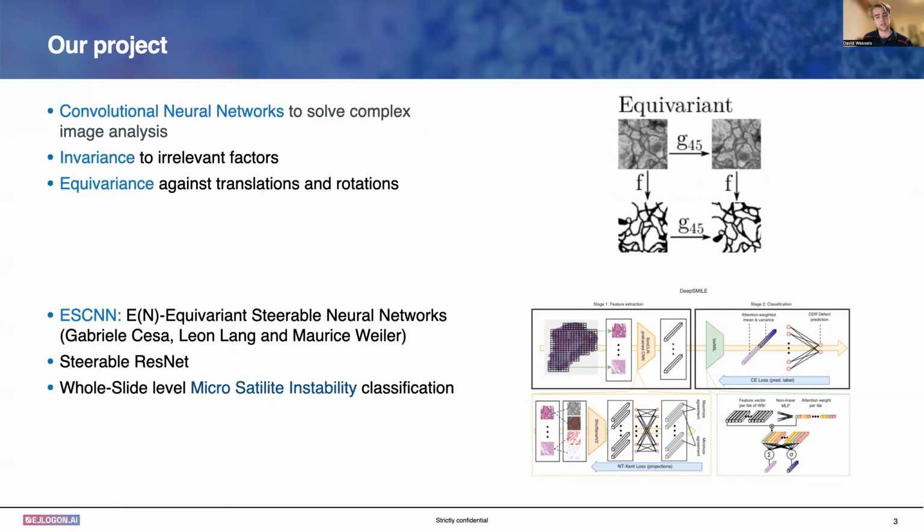For example, within histopathology, image analysis problems require processing a digital slide of stained specimen, whose global orientation is strictly arbitrary, just as during the preparation workflow in the lab. Therefore, we would like to create models which are also invariant against transformations of the global orientation.